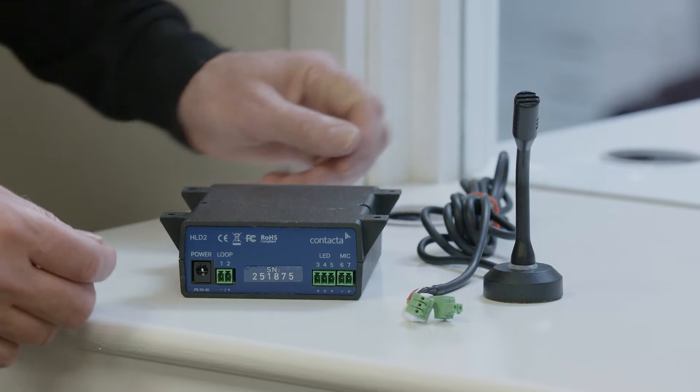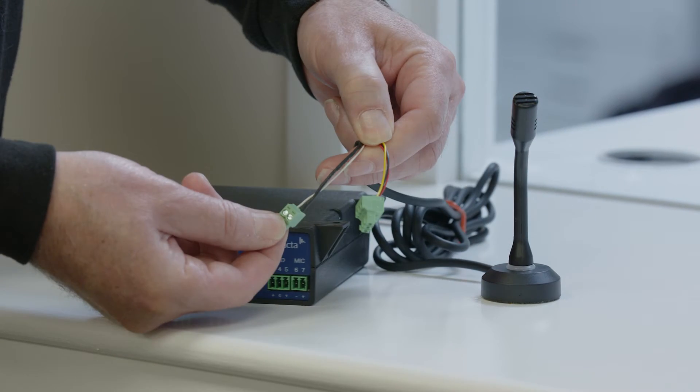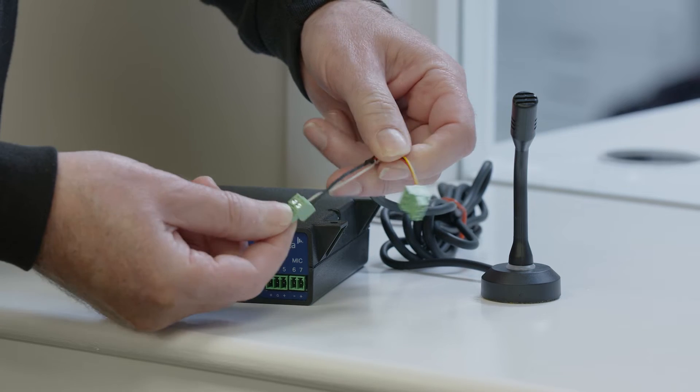Connect the M72 microphone to the HLD2 hearing loop driver. There are two connectors, one with a white cable for the microphone, one with a yellow and red cable for the LED.